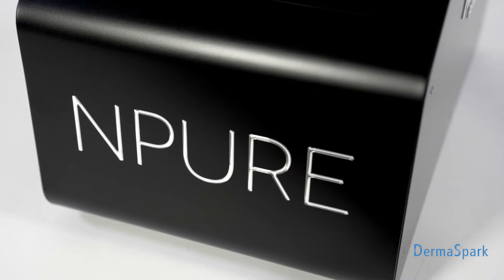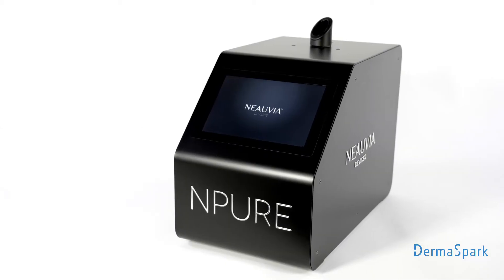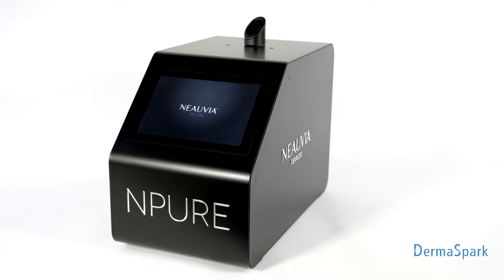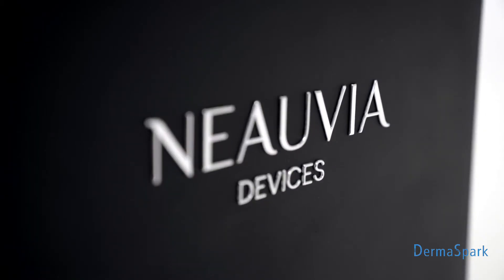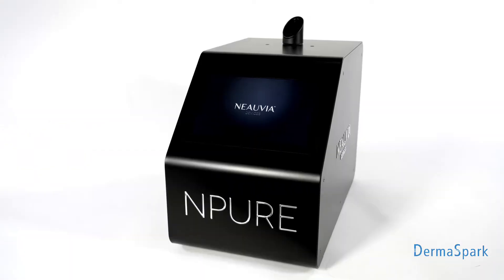N-Pure is an intelligent cleaning device with dry fog production. Particles obtained in production are of microscopic size of 3 micrometers. The device measures a precise dose of liquid depending on the size of the room to ensure all surfaces are thoroughly cleaned.